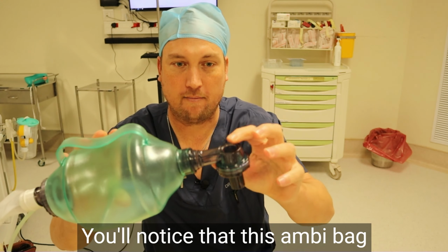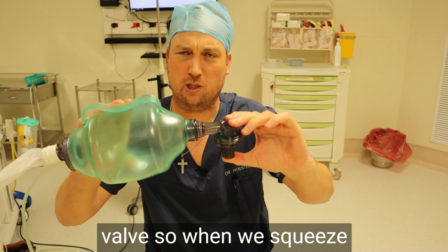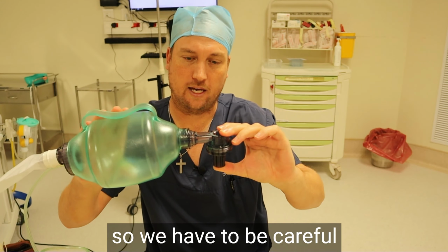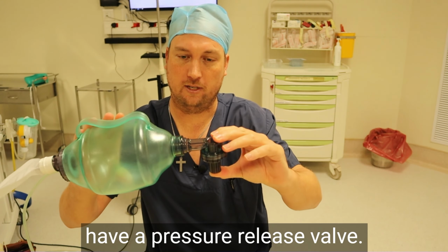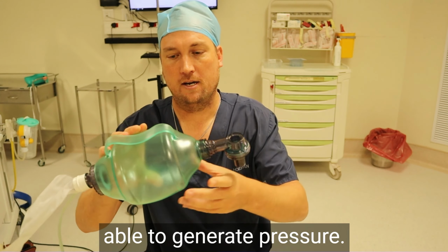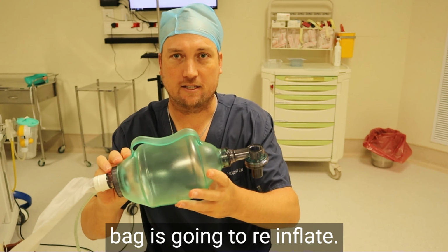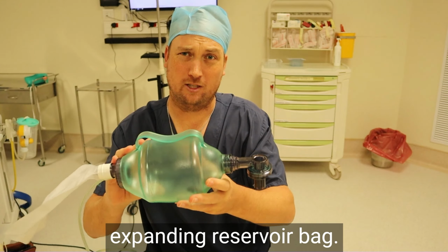You'll notice that this ambu bag doesn't have a pressure release valve. So when we squeeze this ambu bag, we're able to generate very high pressures. So we have to be careful about that. But I'll show you an ambu bag just now that does have a pressure release valve. So we show that we're able to generate pressure. The next thing that we want is to be certain that the bag is going to reinflate. So an ambu bag is a self-expanding reservoir bag.